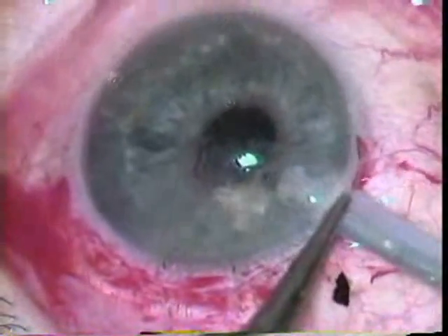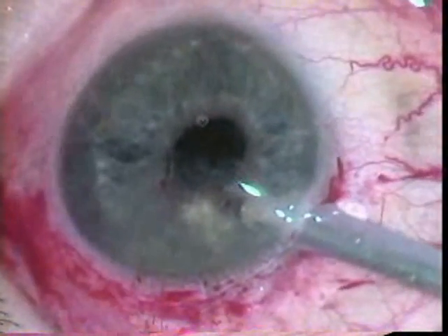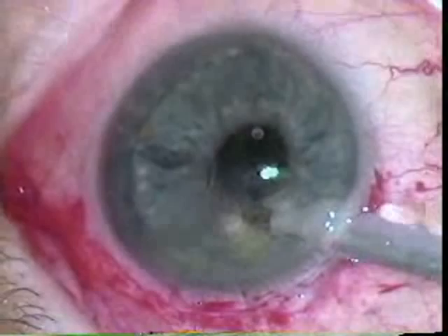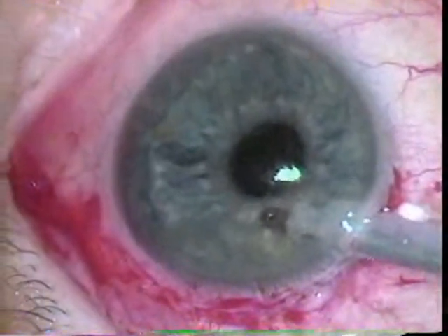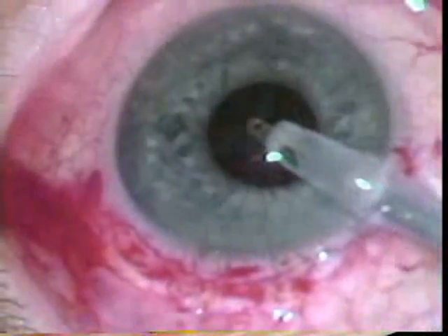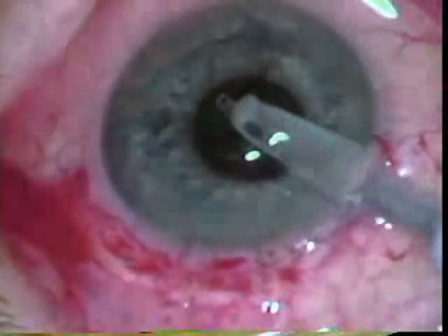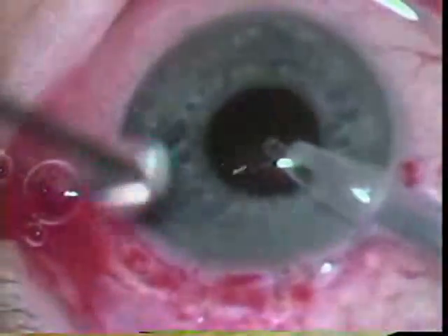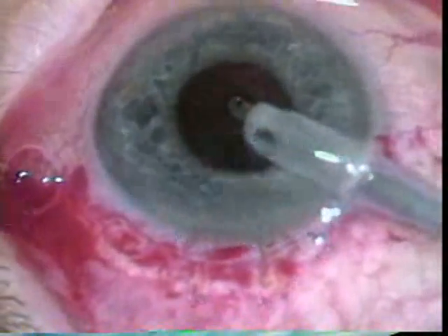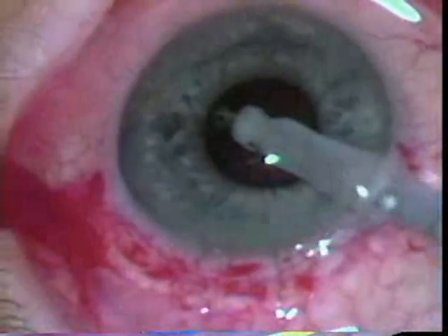Irrigation aspiration is used to remove residual cortical material. You can see how the pupil came down following expression of the nucleus, which was not uncommon when performing an extracap. The pupil got a little bigger during this, probably because of the epinephrine in the fluid.